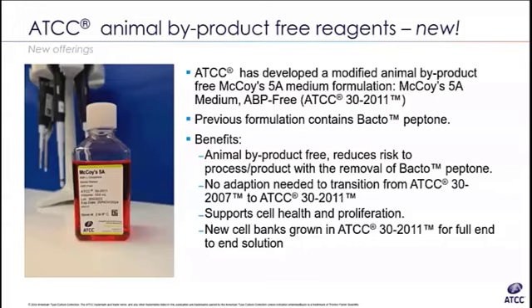Great. Now, this next question, we actually get in quite a bit. And it's, can you use a contaminated culture in your experiments, presumably, after you've treated them with antibiotics? So generally speaking, it's not recommended to use cells that have been contaminated.